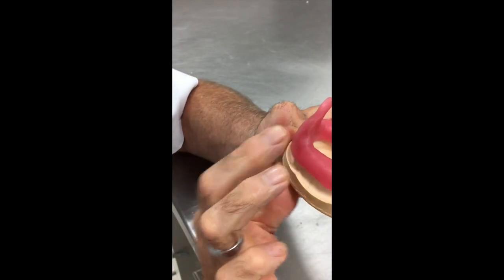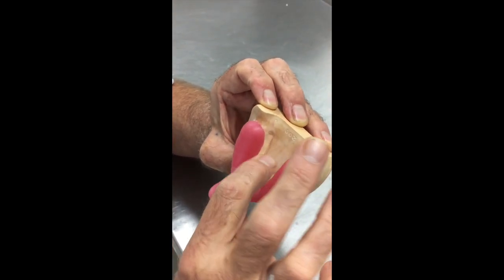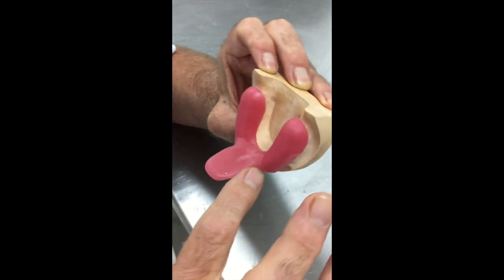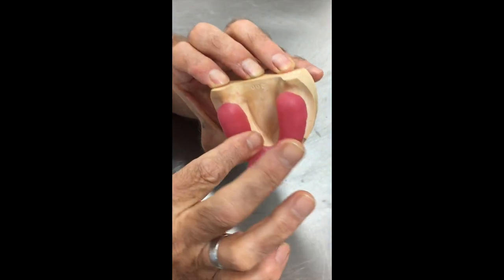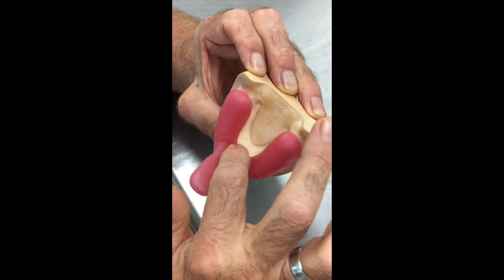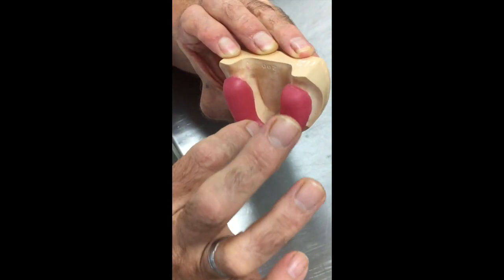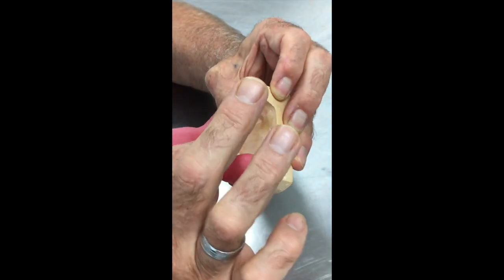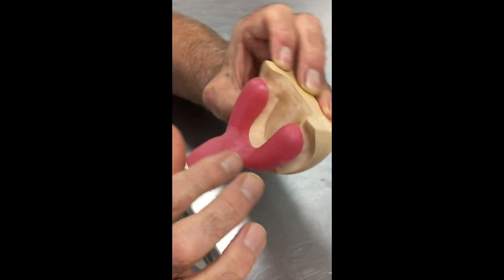Now I'm using a slight dragging and pressing action together here to get this. If we press too hard, of course, we're going to thin the periphery out in that area. We don't want that to occur. And if you get a little white area like this where there's a bit of air incorporated, if you just press it with the end of the finger a few times, it starts to blend that color in. Okay?